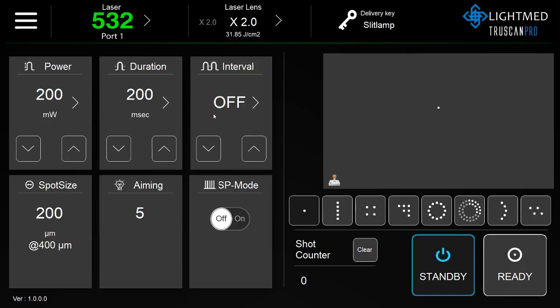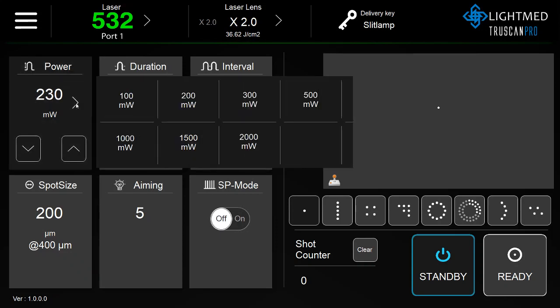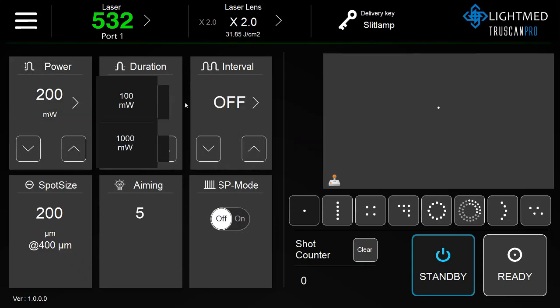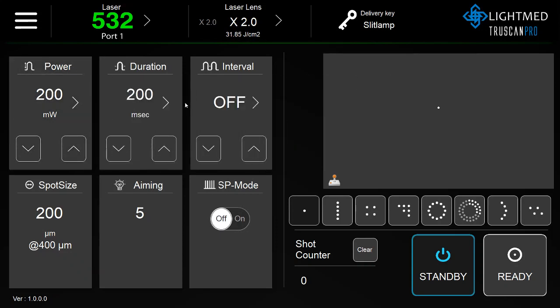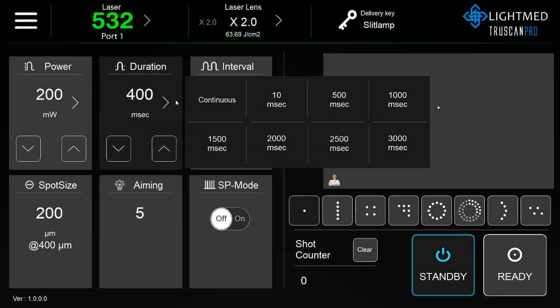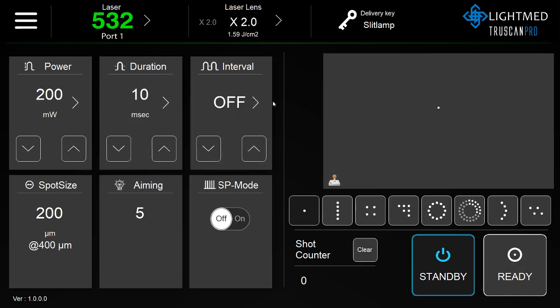In order to adjust the power, click the up and down arrows in increments of 10, or the right arrow to select a preset. The duration is the same: up and down arrow, right arrow for a preset. Same with the interval.